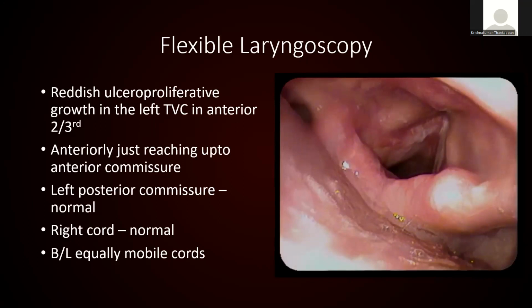So you will just tell the glottic findings? No, sir, definitely. The rest of the larynx was normal on examination. I have come to the detailed examination after we have done a direct laryngoscopic examination, but I just wanted to highlight the positive points here.